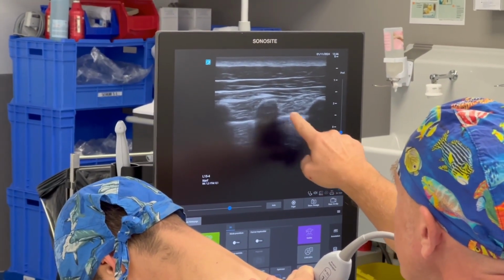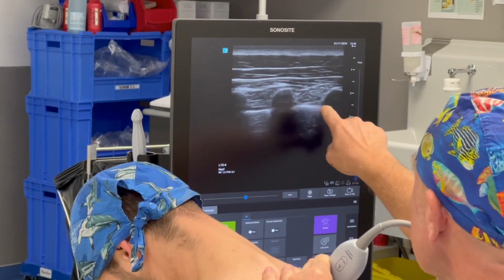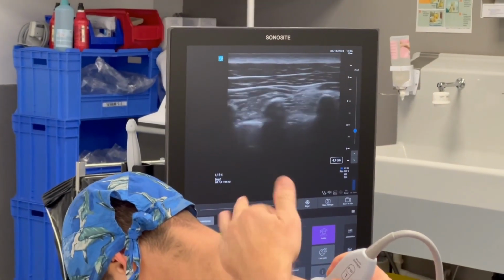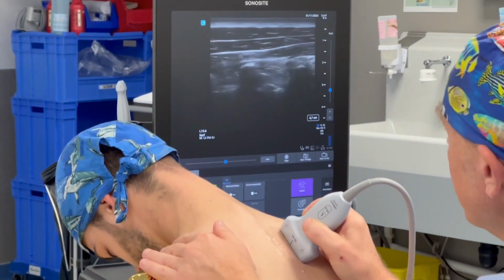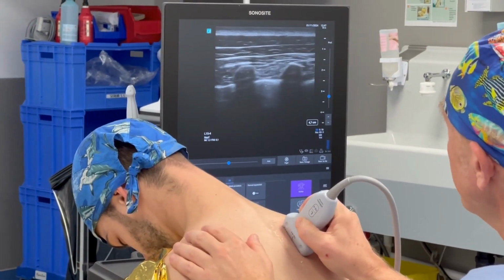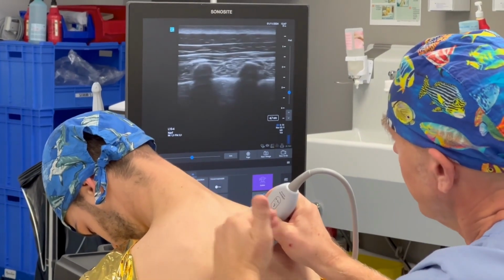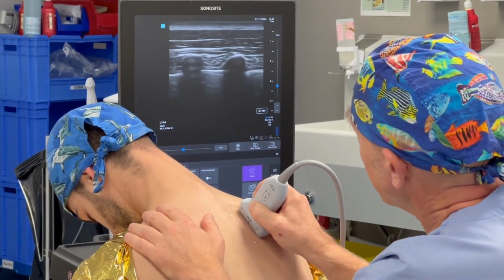It's this little triangle under the ligament, okay? Intercostal transverse. I can't quite remember exactly what it's called. It's this one, and that's the injection site. It's there, and you should see your pleura collapsing, so your needle. You can approach it from here, or you can angle it a bit like this, so you're less bothered by the transverse processes. And as you can see, we find the same outline as at the beginning with the two bony processes. And then the muscles, which are between the two bony landmarks, and can have different names depending on the level you're at. Strictly speaking, it's mainly this aspect of sono-anatomy that's important, and the injection site.